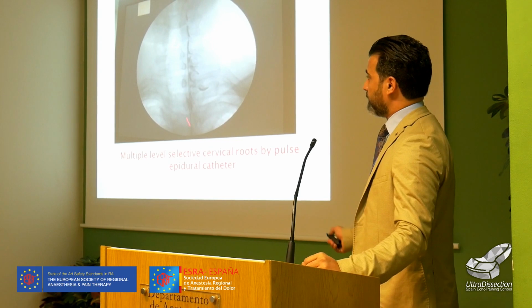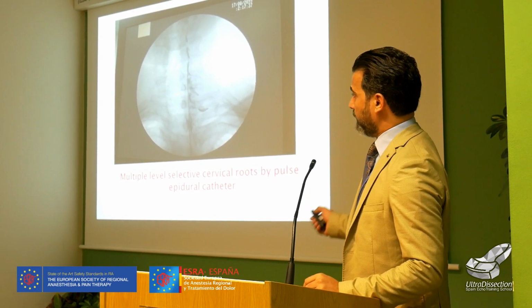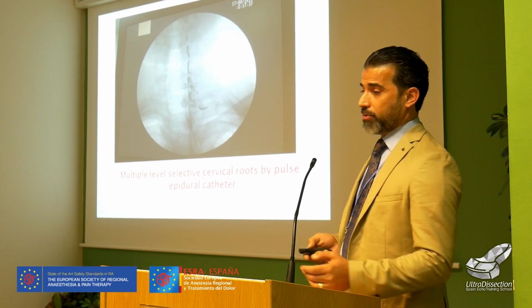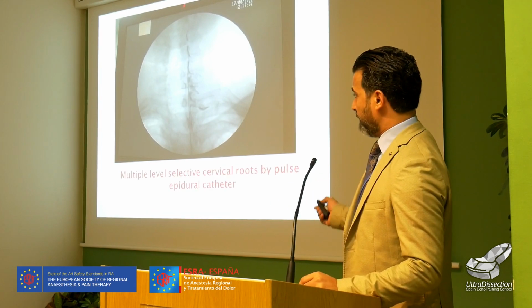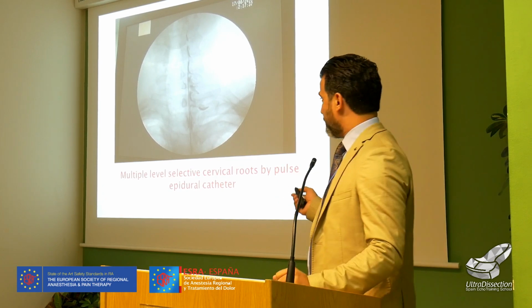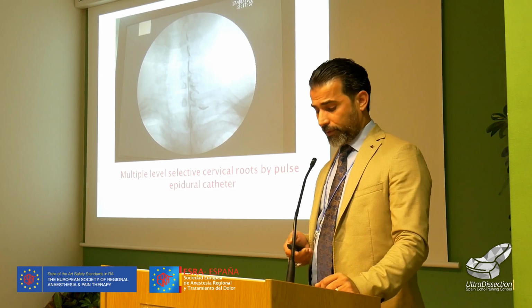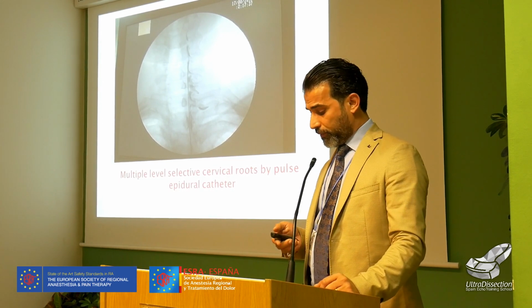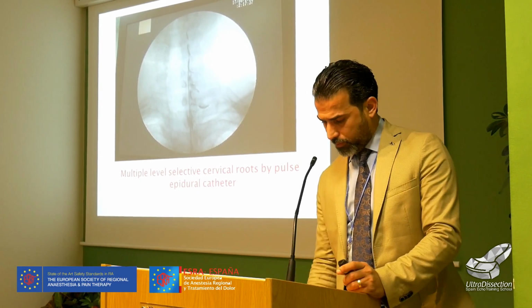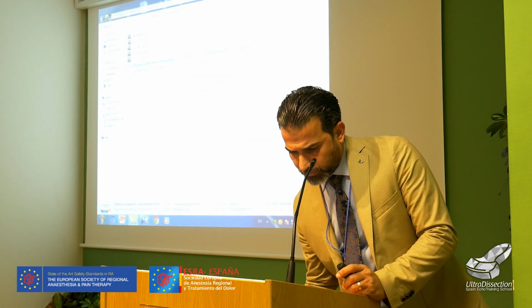But this is the catheter. It's in high demand, and it is so costly, and with all the procedure here, you need a definitive pathology or disease to do this selective. This patient has a myelopathic spinal cord because of multiple disc prolapses, and the patient needs pain control and also stimulation of the roots for motor and sensory. I want to show you some videos.